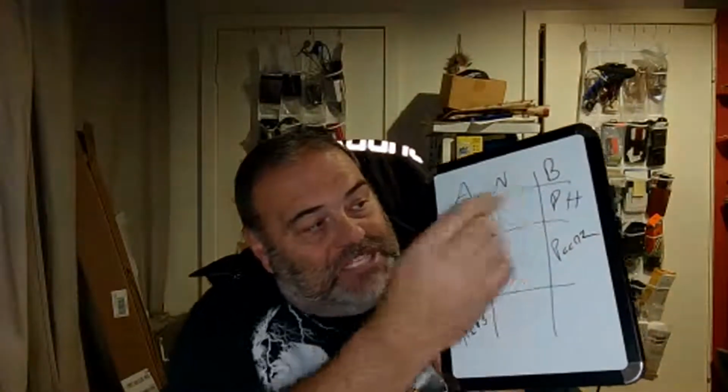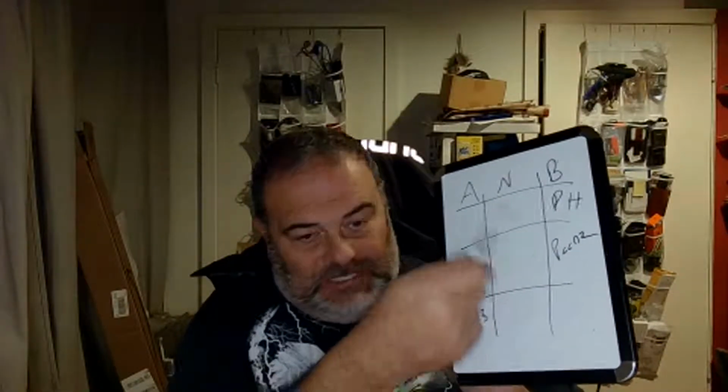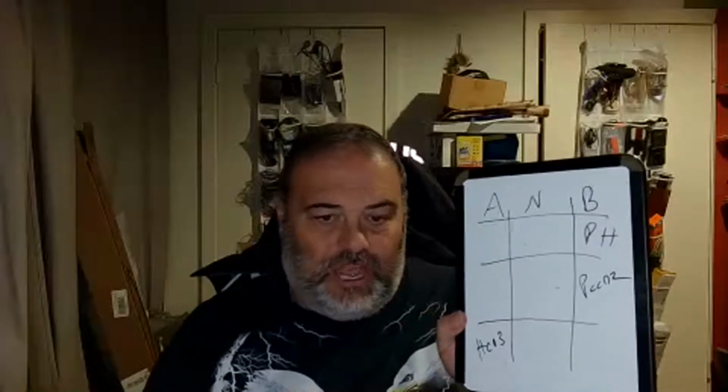So once we lay out where all three components go on our little chart, all we have to do is read the chart. The pH tells us what our patient is. Well, it's over here in the alkalotic category. So our patient's alkalotic. Respiratory is in the same column. So we know respiratory is to blame. So we've got respiratory alkalosis. So then we want to look at compensation.